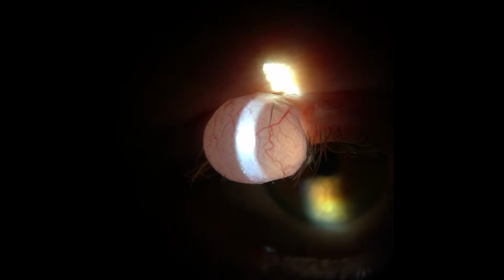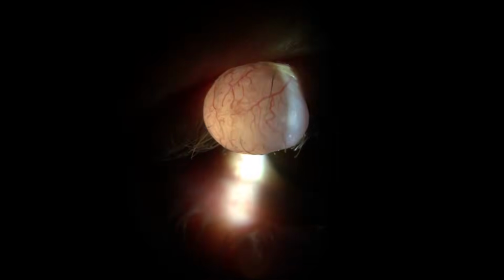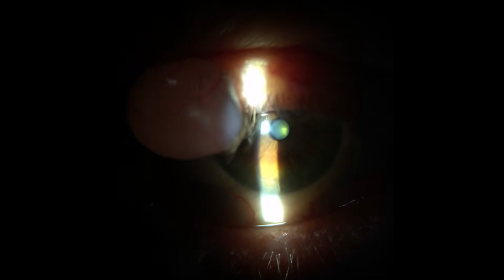So again, you can see that eyelash right there within the cyst, which kind of tells me that was probably the reason why the cyst formed in the first place. Maybe there was a foreign body reaction from that eyelash and caused the body to encapsulate that eyelash.